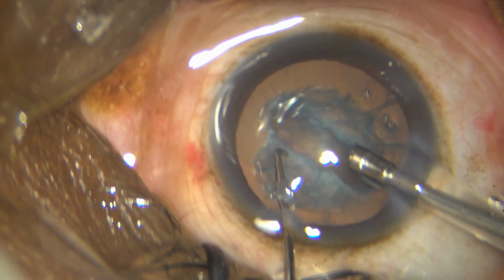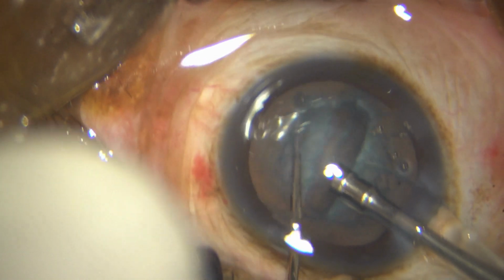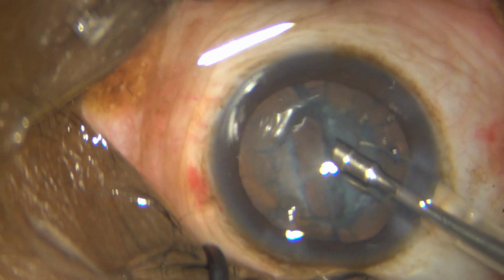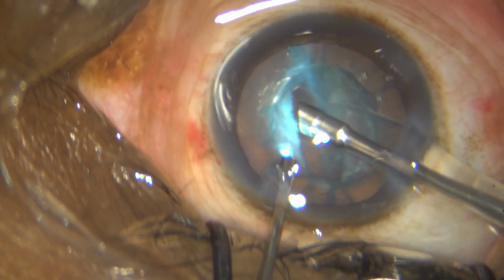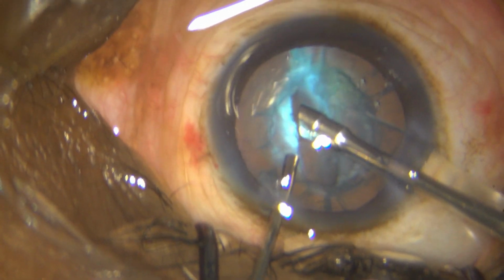All in all, I take in my dialer and make the first crack, turn it around, make the second crack, take off my dialer, and get in again with my endo illuminator. I plan to eat up these pieces with my phaco probe under endo illumination or lateral illumination. So again, out go the lights, and it's just like a science fiction movie. The piece is coming out.